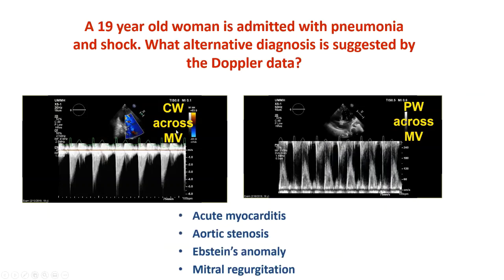Here's CW across the mitral valve in a 19-year-old woman who presented with pneumonia and shock. This is a transmitral flow at high velocity — 180 centimeters per second. The diagnosis is acute severe mitral regurgitation. This departure from the normal parabolic mitral valve envelope indicates that the pressure in the left atrium is rising dramatically.